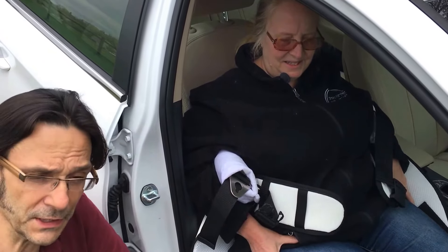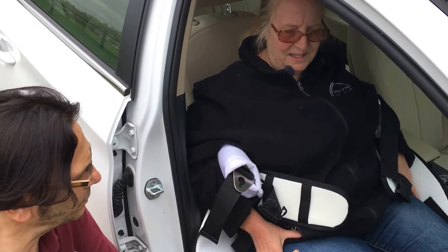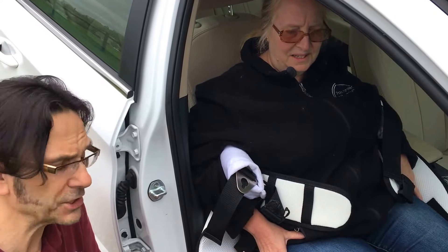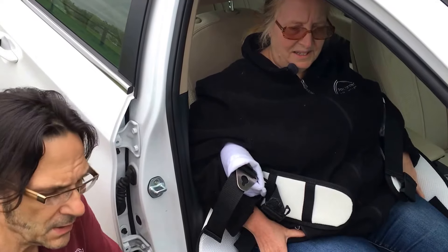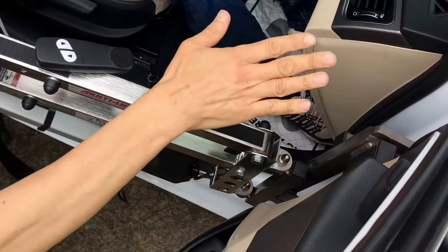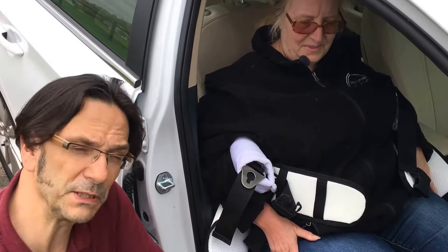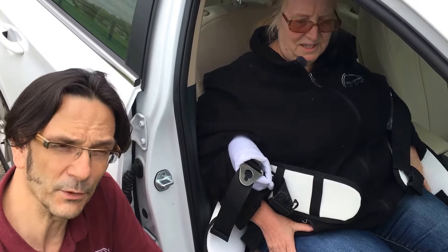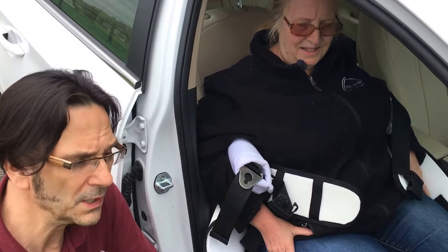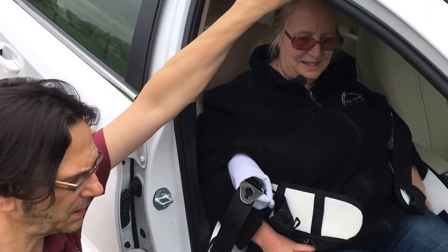Hi, and thanks for tuning in to Access Unlimited's YouTube channel. Today we're going to show you how you can use your multi-lift system in combination with the combo sling to solve a very specific problem: when you're traveling, how do you lift a person up to be able to either change clothing or change a diaper. We're going to focus on a vehicle with a low roof, which presents a particular challenge in transferring.